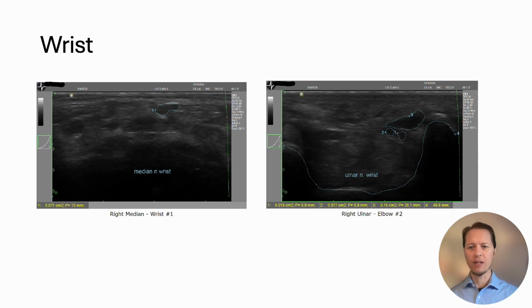If you track it and follow it, it'll continue right along here, go right over pisiform, and then continue down to the abductors of the hand. We do see that fairly commonly. I think about 10% of the population have it. I have never once yet seen it actually cause mass effect or compression over the ulnar nerve or artery, but sometimes we do come across it, so don't be surprised if you see that on ultrasound. Again, good information to know. In this case, it did not seem applicable.